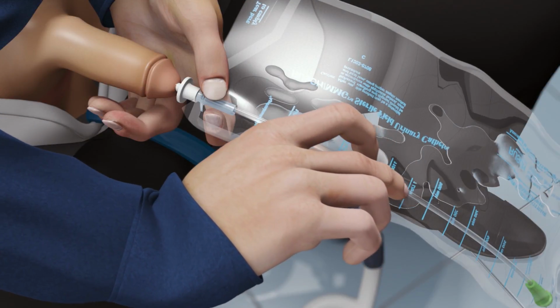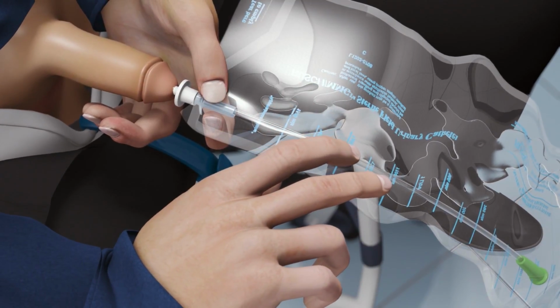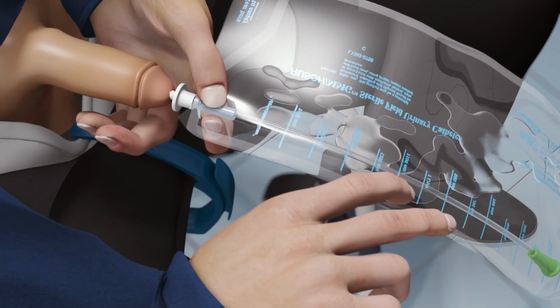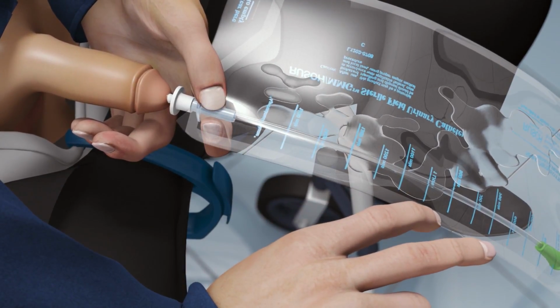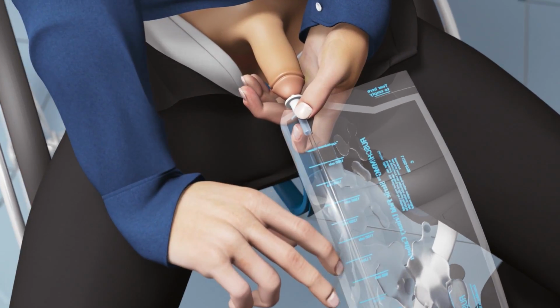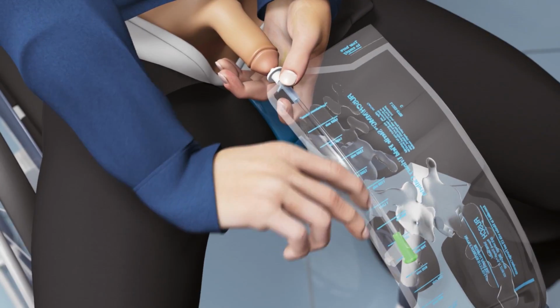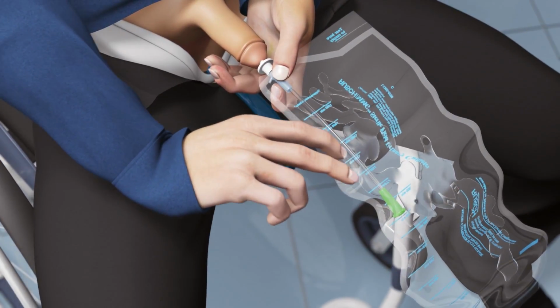Using your right hand, begin to advance the catheter into the urethra 1 to 2 inches at a time. After each push, pinch the split introducer guide to hold the catheter in place while you straighten the bag with your right hand. Continue advancing the catheter until the catheter has entered the bladder and urine begins to flow.